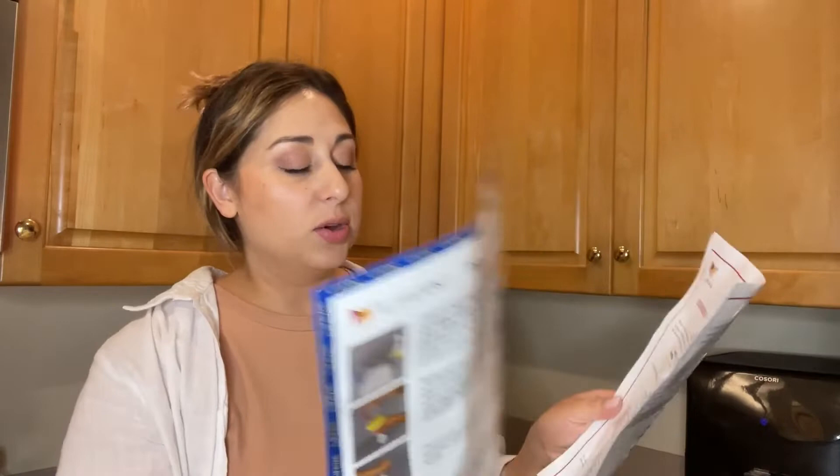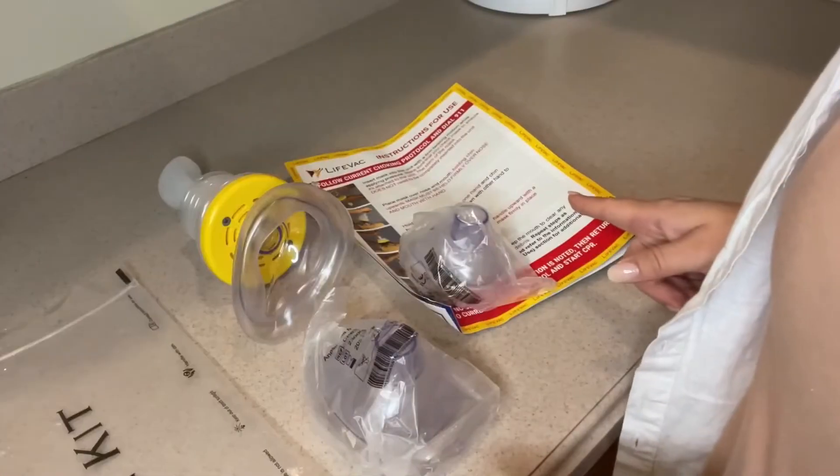They recommend that you get CPR certified, that you call 9-1-1, and that you follow all the protocol. So make sure you read the instructions thoroughly.